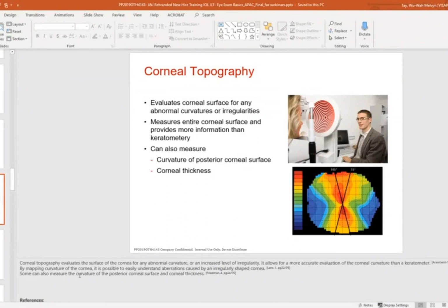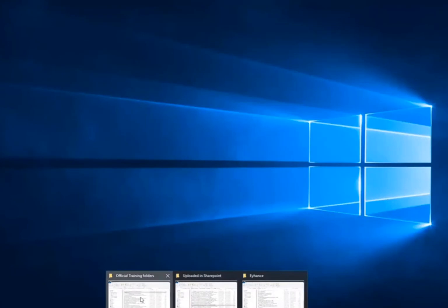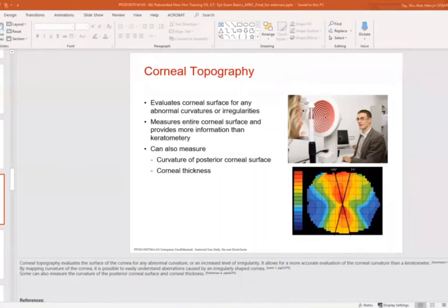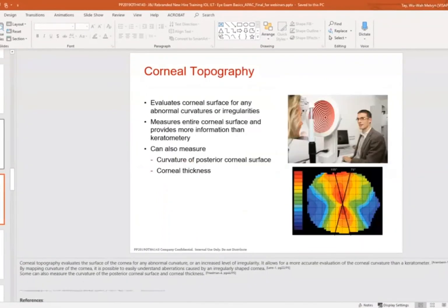Okay. But when it comes to manual or auto keratometer, both of them at least measure the very central part. So manual is measuring somewhere around 3.2 mm, and the automated ones are measuring somewhere around 2.5 mm. So the central part, any which way, they are measuring. So why in that case will the corneal topography be extrapolating values from the periphery to the center? Because the part which was measured was the center part. So why from the periphery to the center then?